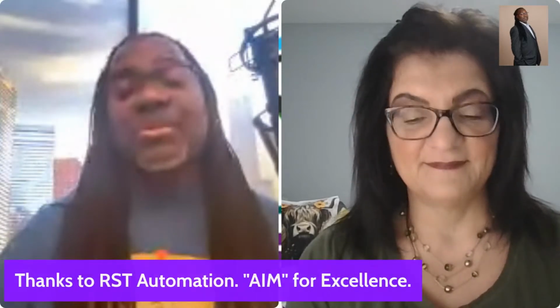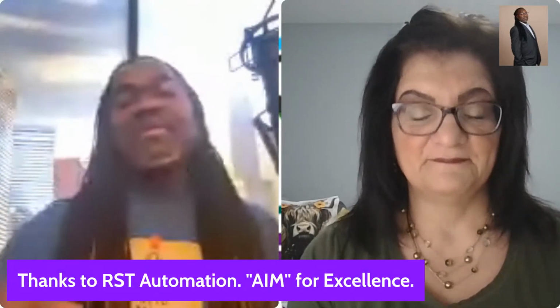I don't want to interrupt your thought, but you said something I want to touch on real quick. I know a lot of people probably disagree, but is it truly not an error until it hits the OR? If we were doing quality checks in SPD and I found it, am I not to bring it to your attention because it didn't make it to the OR, or is it still considered a near miss? How do you handle those? Because that goes back to employee safety. It still goes back to patient safety because we almost missed it.